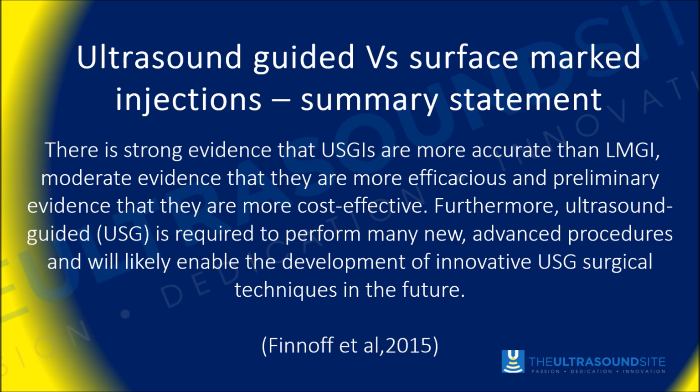We might start this talk by considering a statement by Finoff et al. 2015 that summarizes that there is strong evidence that ultrasound guided injections are more accurate than landmark guided injections, with moderate evidence that they are more effective and preliminary evidence that they may be more cost effective. Furthermore, ultrasound guidance is required to perform many of the new advanced procedures and will likely enable the further development of innovation of ultrasound guided surgical techniques in the future. So again, straight away, we're looking at a much broader landscape, a much broader context around this whole topic area.